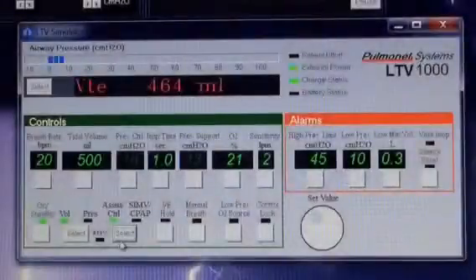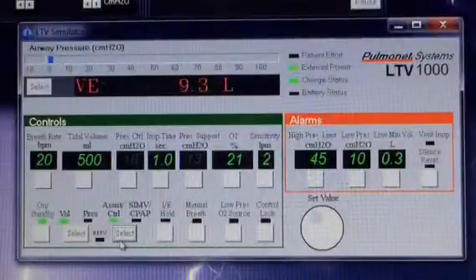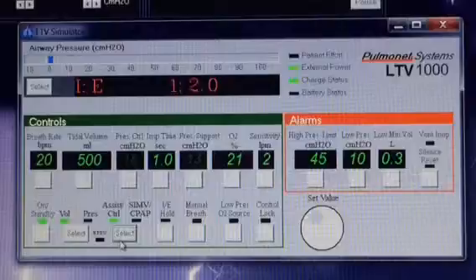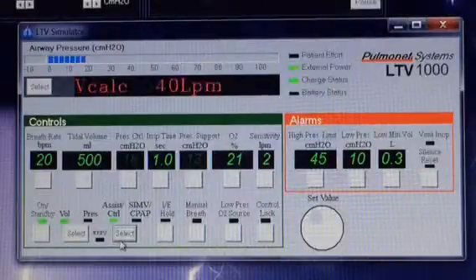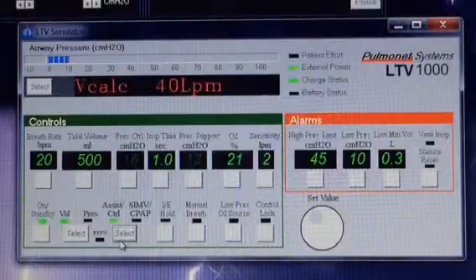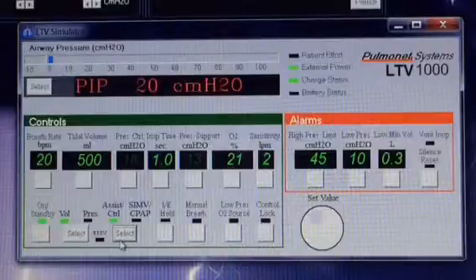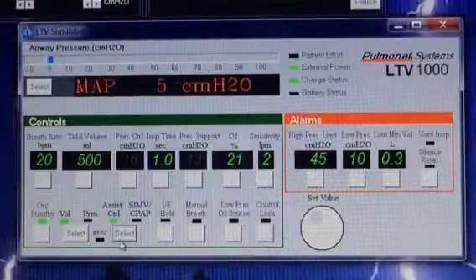Hello, it's Wes, Super Wes, that is. In this video, I'm going to explain what the assist control mode is on the LTV ventilator. It's pretty much a universal mode on other ventilators also.